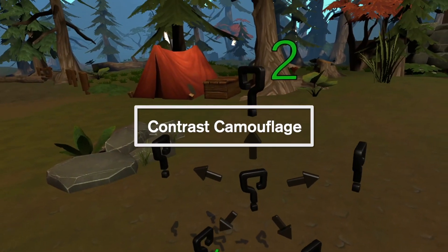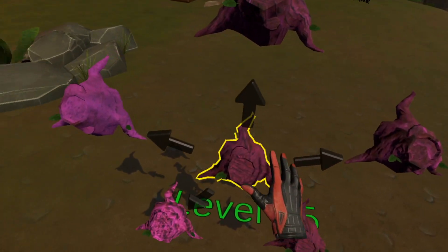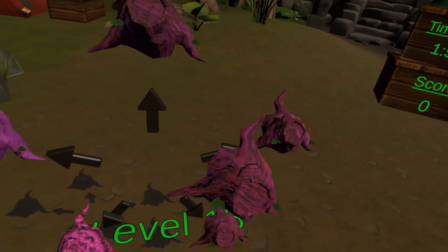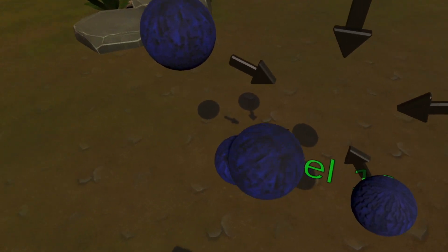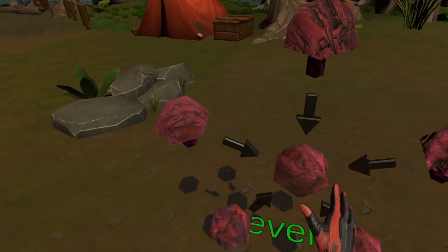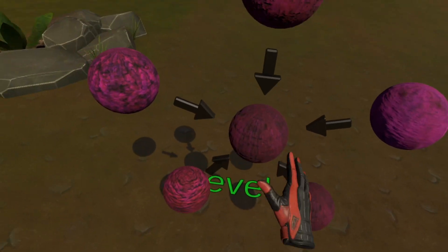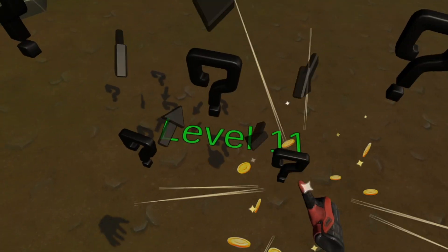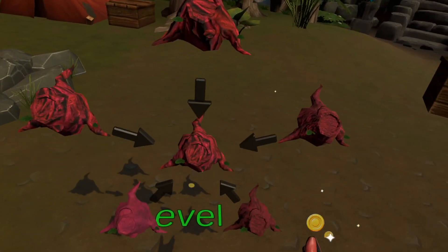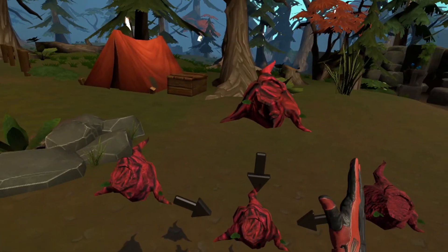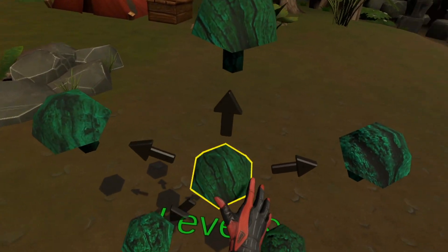Next we have Contrast Camouflage. This is a visual discrimination activity where you need to match the center object with the same texture and details as the peripheral objects. Similar to color discrimination, you need to grab the object in the center and then move it to the matching object on the outside. The Easy, Medium and Hard settings adjust the number of objects you'll have to match.